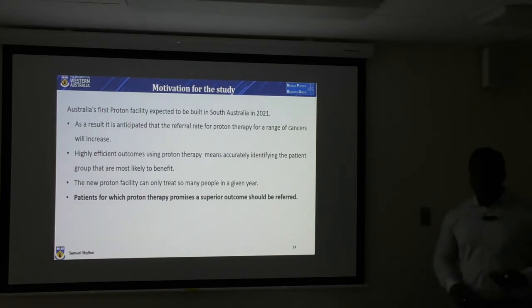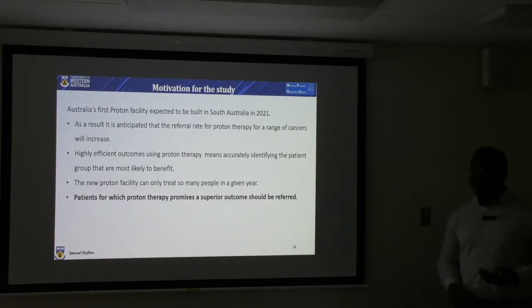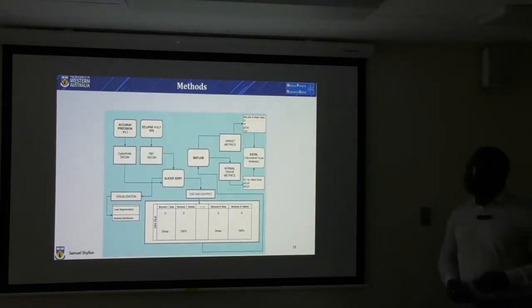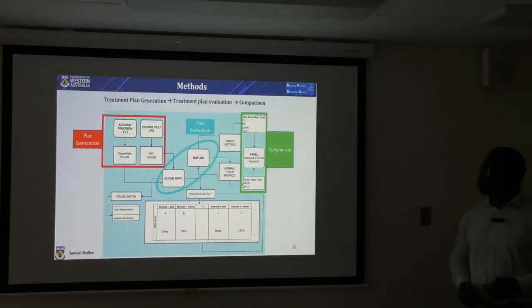Considering that CyberKnife has been used for the past 5 years, it has been established, and it serves as the benchmark for what is clinically acceptable. So we want to see cases and situations for which proton promises far superior outcomes. So the materials and methods can be simplified into 3 stages: plan generation, plan evaluation, and comparison.